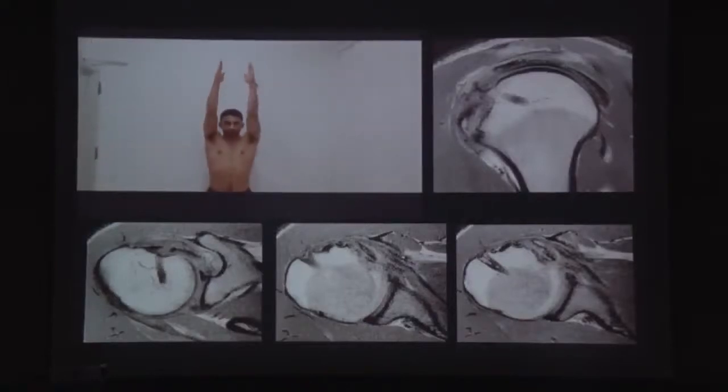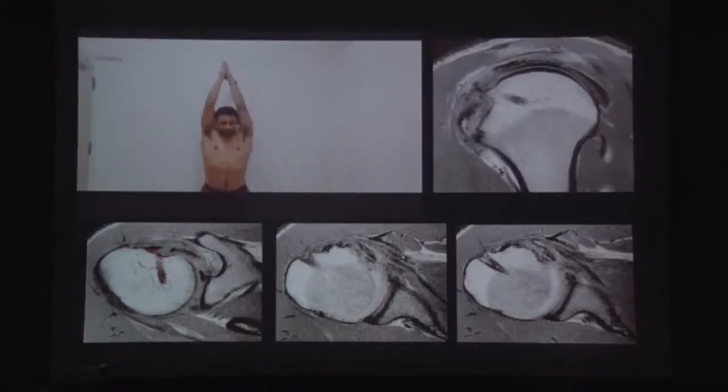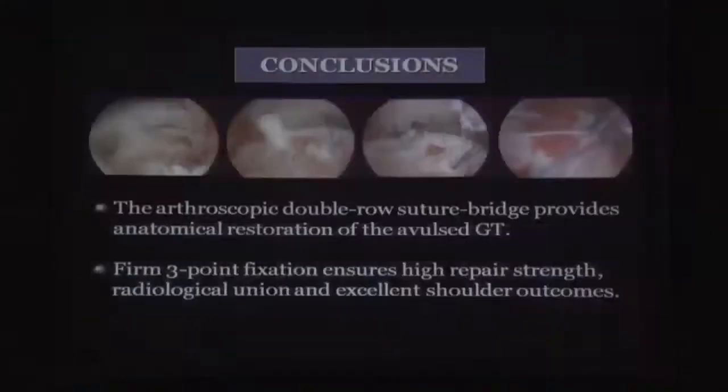The medial row anchor, the entire footprint, and the lateral row anchor together allow the fragment to sit down into place. Arthroscopic double row suture bridge repair provides good anatomical fixation with firm fixation, and as previously reported, it yields good radiological union and excellent outcomes.